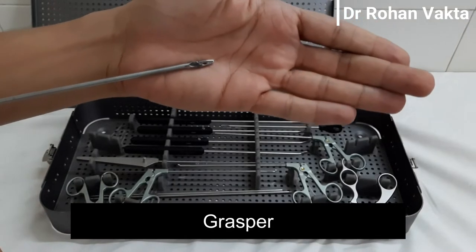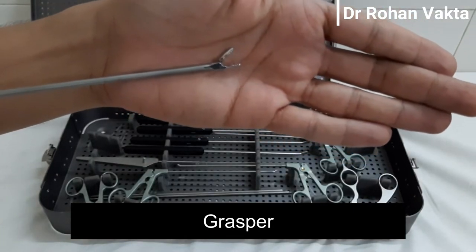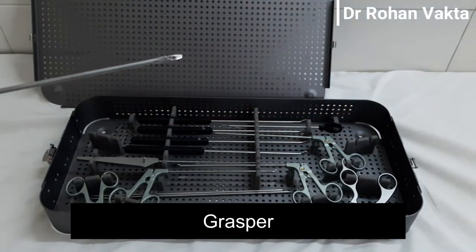This is the soft tissue grasper. It is used to pull rotator cuff tendons while doing cuff repair, or the capsule labral structure while doing Bankart repair.